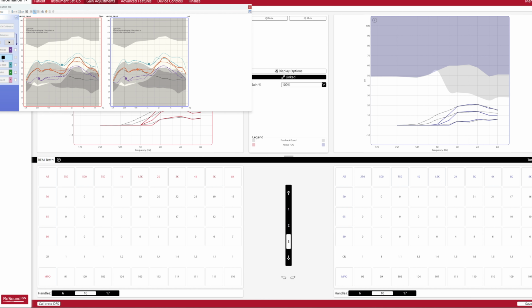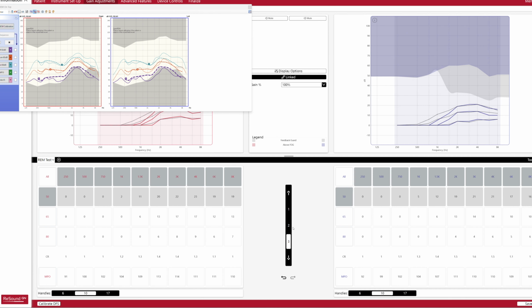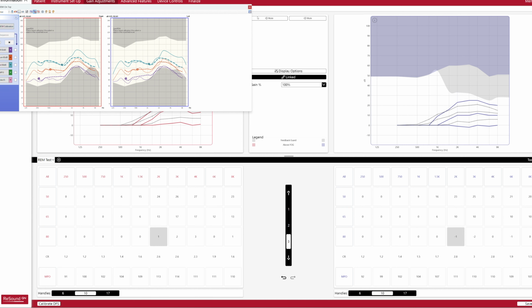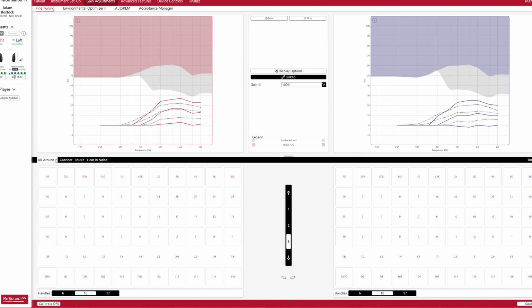Once we had them connected, we ran a real ear measurement. This is an important part of any hearing aid fitting to ensure the hearing aid is giving you the sound it says it should be and takes into account the various shapes and sizes of different ears. We ran this and then added a few of the different programs, making sure they were comfortable, saved it, and we are on our way.